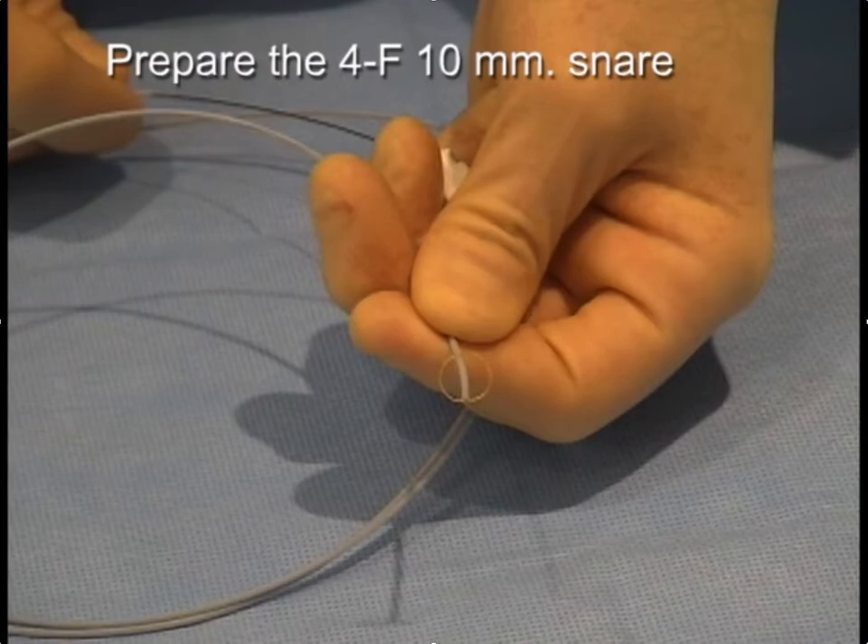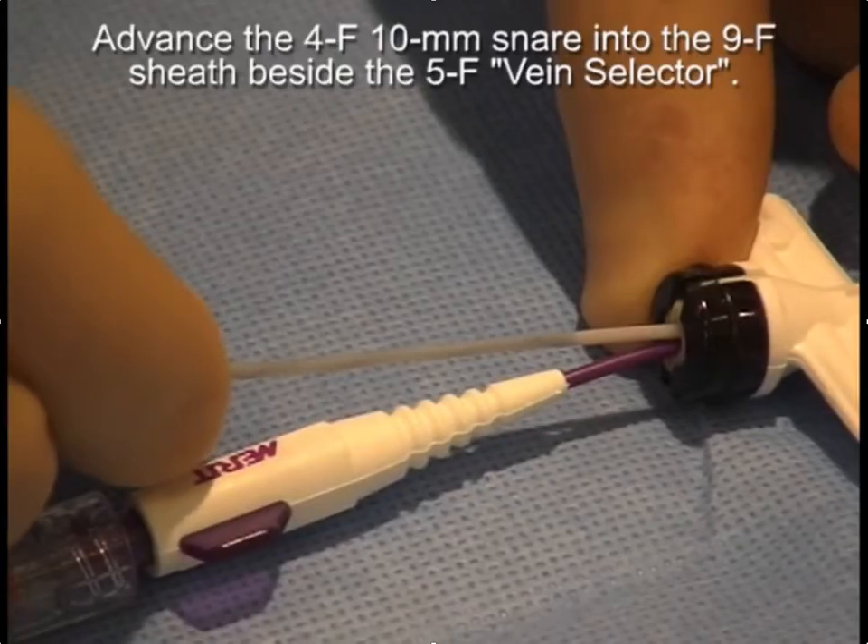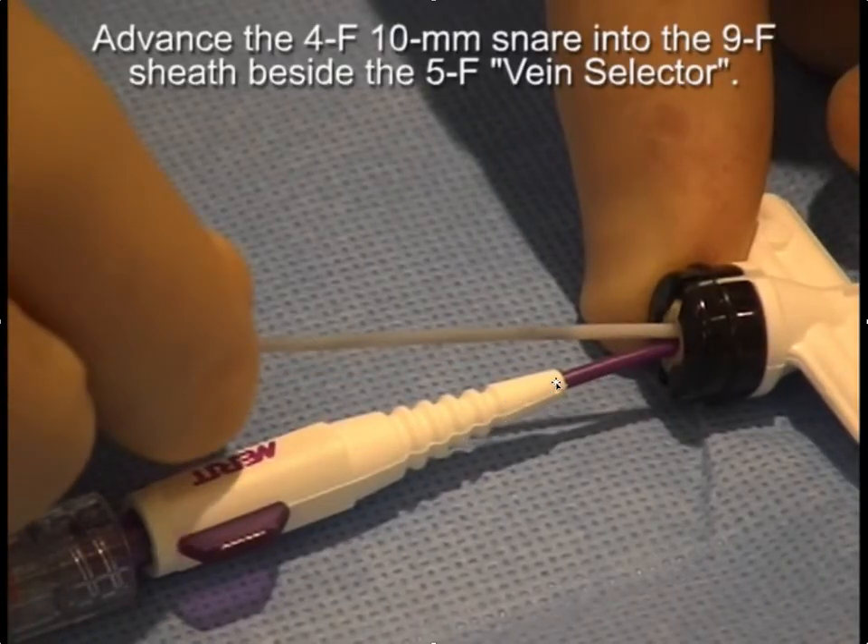Once you have the wire through the collaterals, you're going to want to put the snare in, and the snare needs to fit beside the vein selector. We have a four French snare with a 10 millimeter loop that goes through a four French snare catheter. You will put that into the sheath beside the five French vein selector.